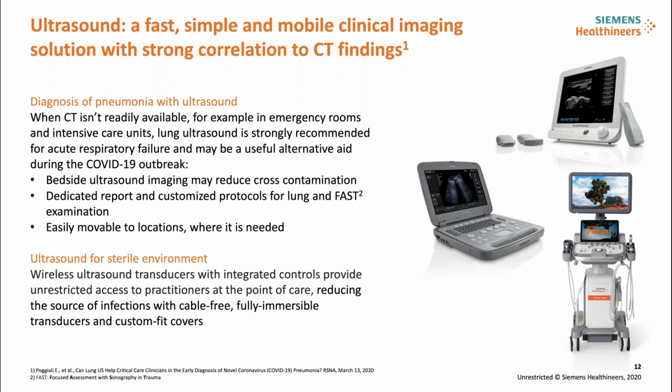And it's usually better if you can bring an ultrasound to his bed instead of having to move the patient completely, with doctors, with the ventilator, with everything, into the CT room. And usually the CT room can be far. You have to take the elevator. All those things can be very bad when it's a critical patient. Sometimes the CT is right there, so it's very convenient and nice, but not all the hospitals are designed with coronavirus in mind. So this might not be available everywhere. So this is the first point.